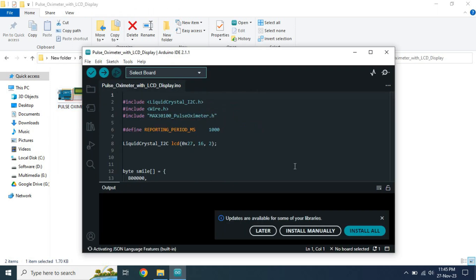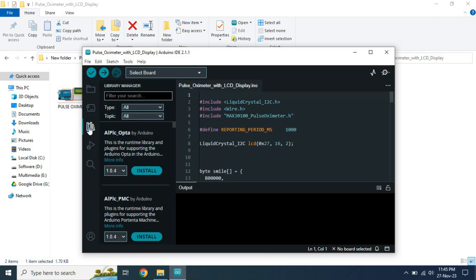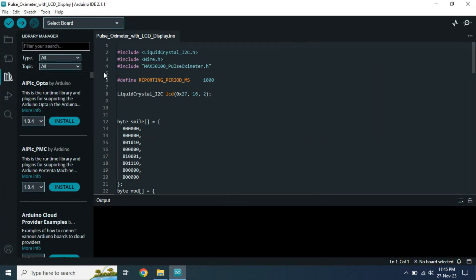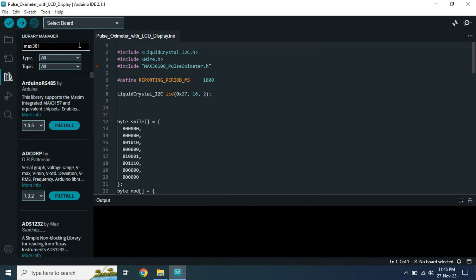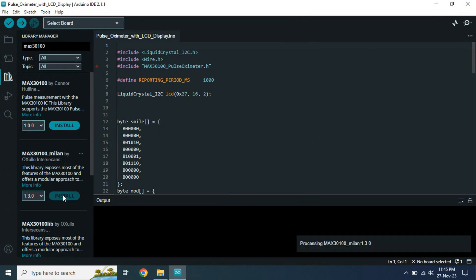At first, we need to install a library. Go to Library Manager, search MAX30100. Now install the library which name is MAX30100_Milan.